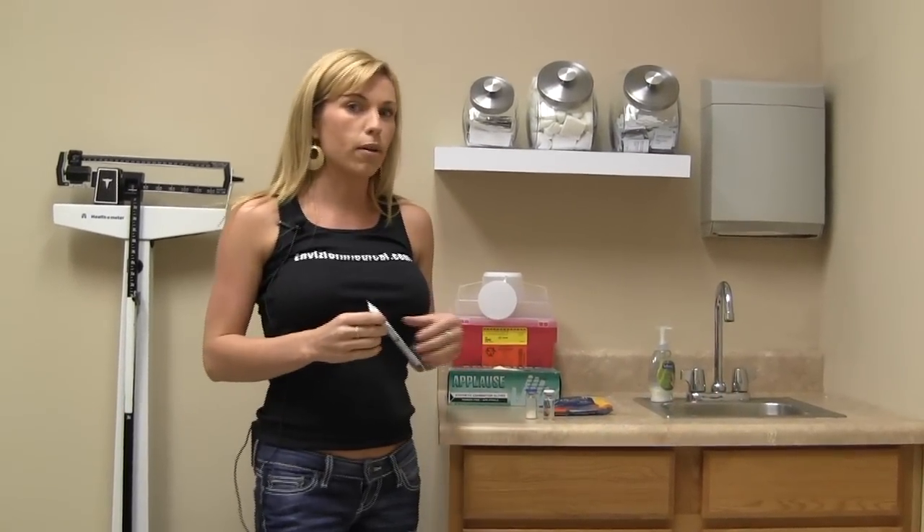Hi, I'm Kathleen. I'm here at Envision Medical and I'm going to show you a little bit about reconstitution.